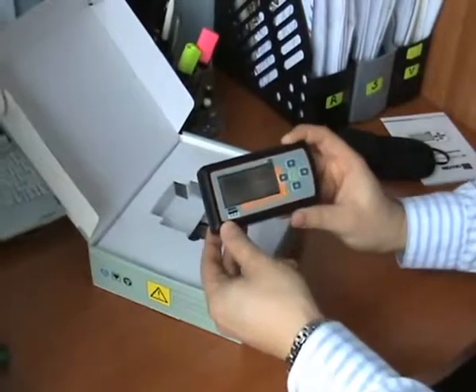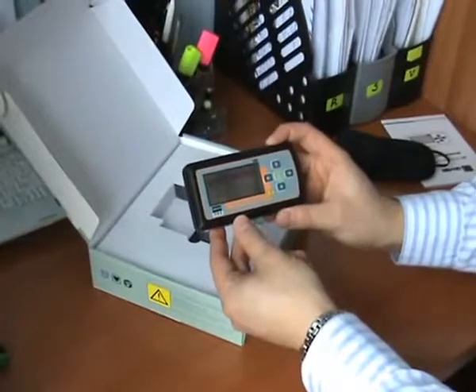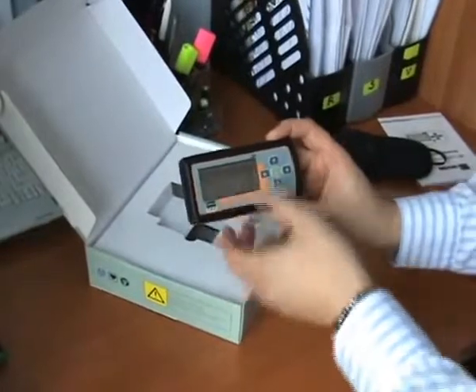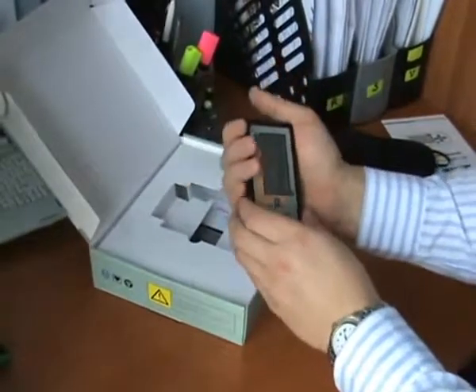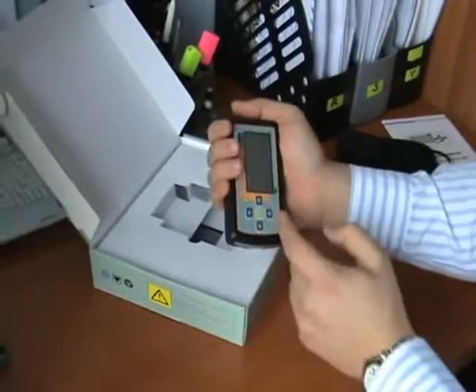Push this button and the ECG will start. In the top of the menu there are measurement options.